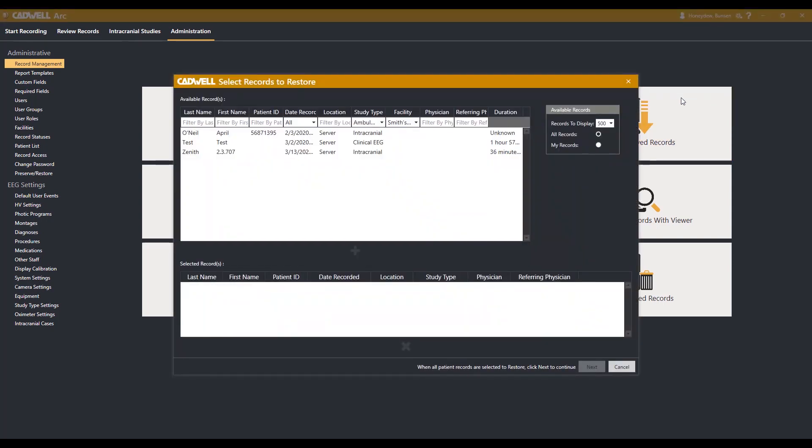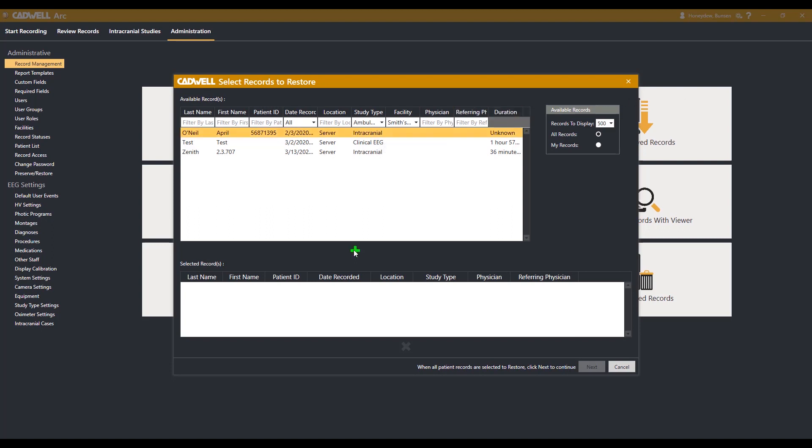From this window, you will see a list of studies that can be restored from archiving. Select the study you would like restored from archiving and hit the green plus in the middle of the window. This will add the EEG data to the list of studies to be restored from archiving.